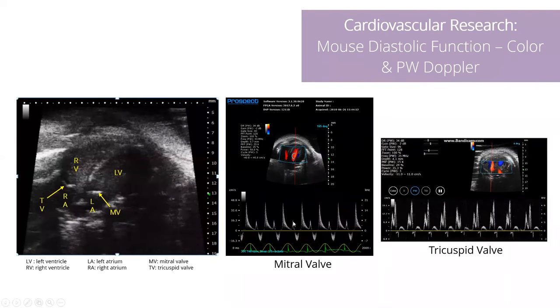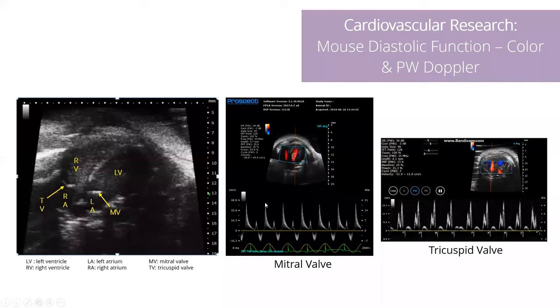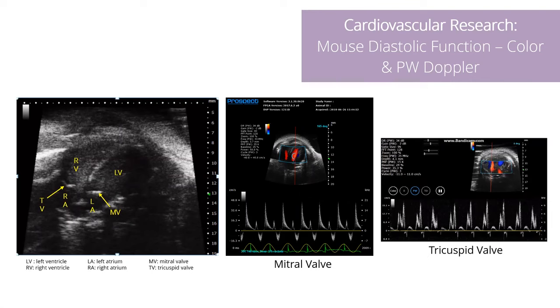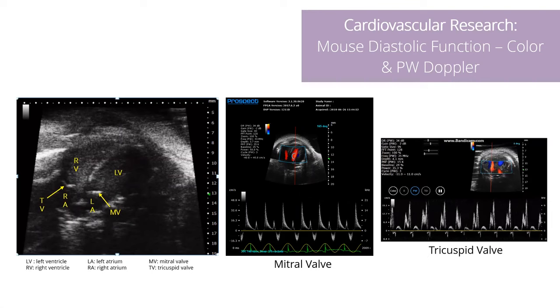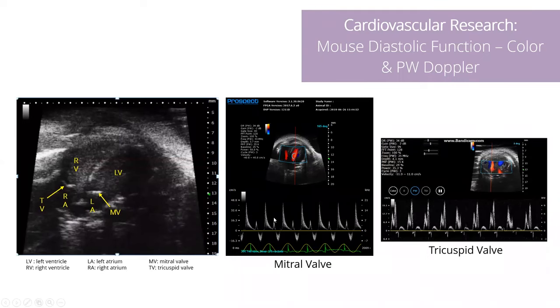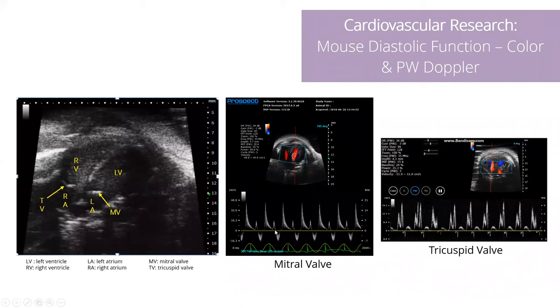As a heart stiffens or there are changes in how it's functioning in diastole, the E wave won't be as high, because the ventricle is no longer able to relax quite as well as it used to. So the atrium has to work very hard to push the remaining blood through, and we see a rise in the A peak. It's typically this E to A ratio and different timing intervals that we measure here, which tell us a lot about diastolic function.